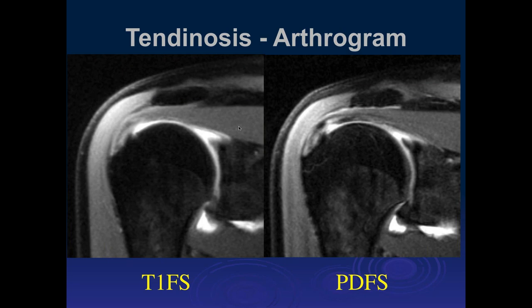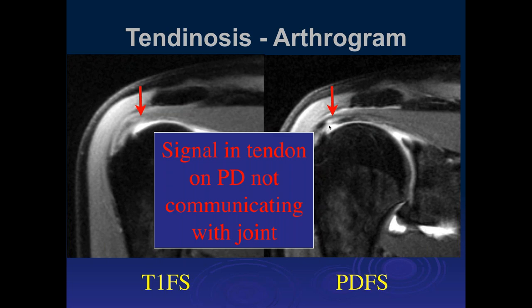Here is tendinosis in someone who had an arthrogram. One thing to be aware of is that when you get tendinosis, you have very friable tissue that tends to absorb contrast from either IV or arthrographic injection. So tendinotic tendons can enhance with contrast and imbibe it — as we can see here with the increased signal intensity within the supraspinatus tendon.